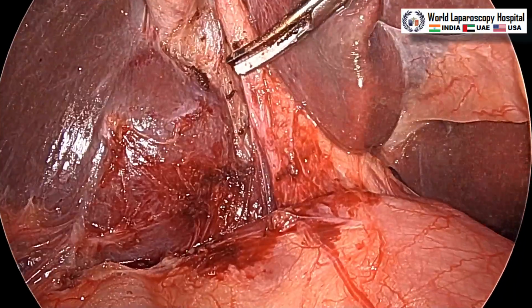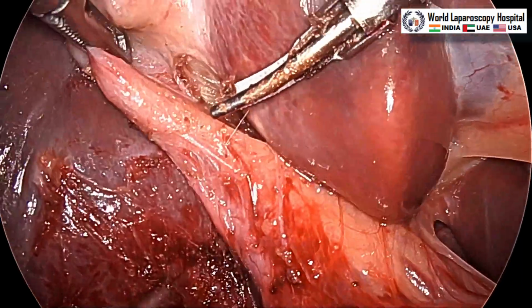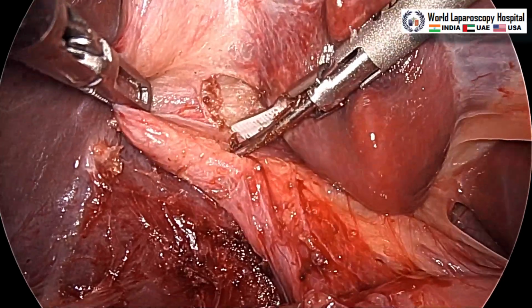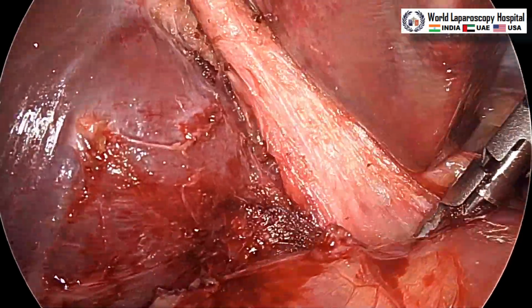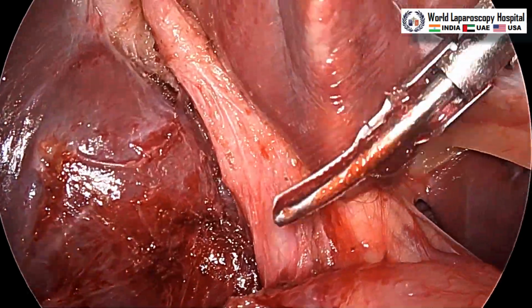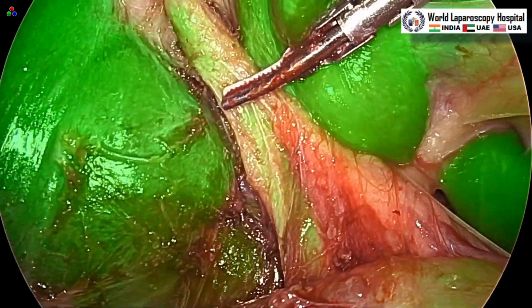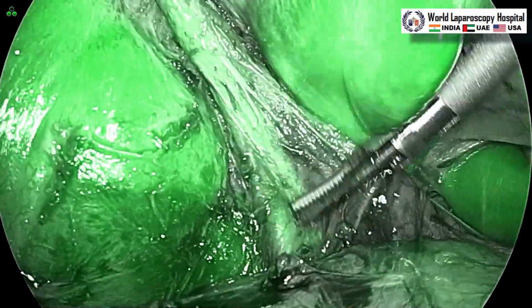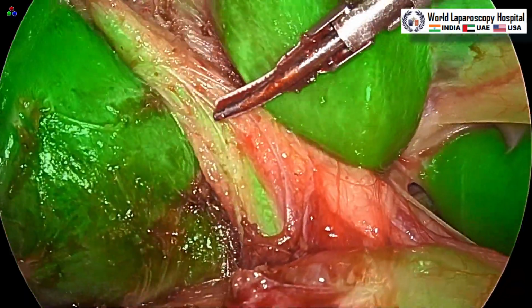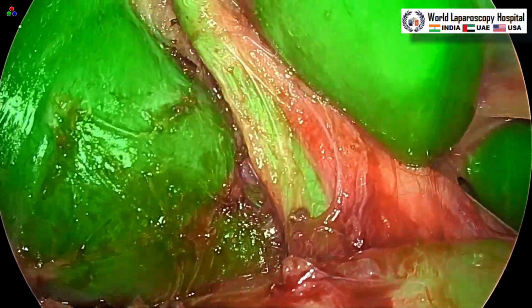Now, a little bit of peritoneum over the cystic pedicle will also be separated, that is skeletonization of the cystic pedicle. Below is the cystic plate and this peritoneum will be separated, so that we can make the anterior and posterior window by Maryland. We can see this is CBD and this is ICG mode. ICG mode is showing the CBD and this is the cystic duct. This is contrast mode, ENV mode. Different modes are there in the camera, that is 1788 camera. And this is the cystic duct.